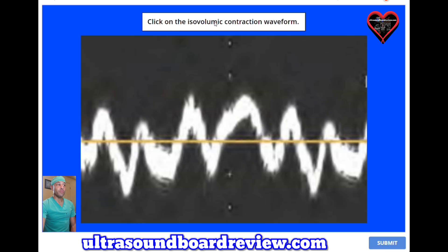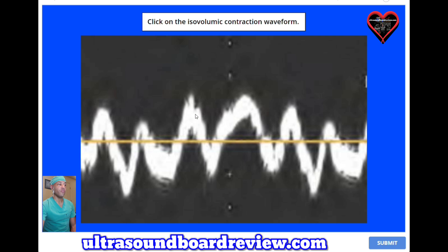Click on the isovolumic contraction waveform. The answer is right here in this region. This waveform is the isovolumic contraction time.